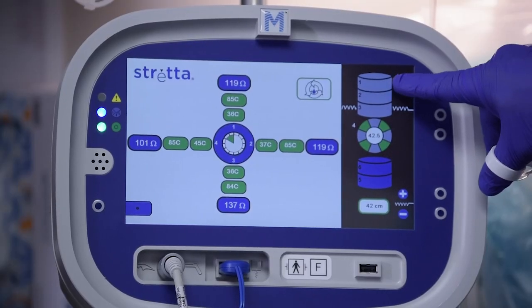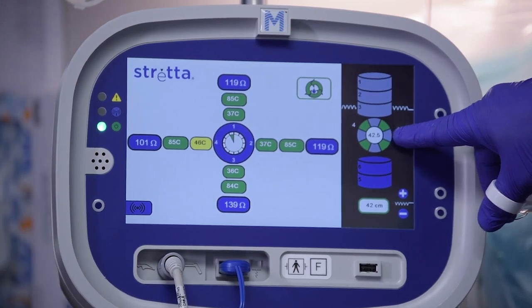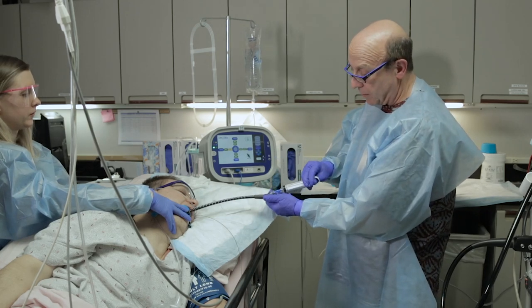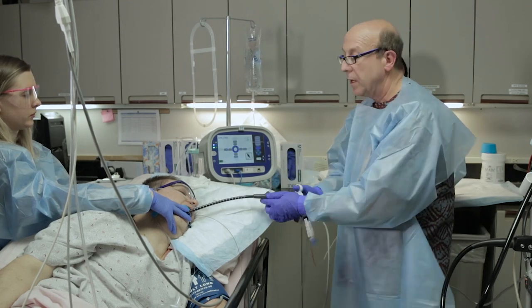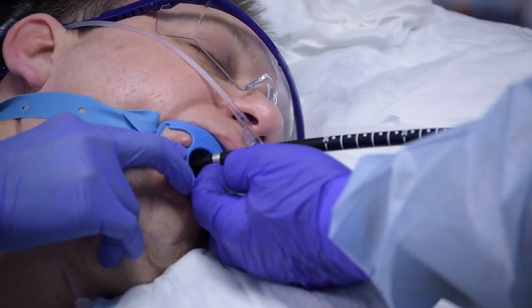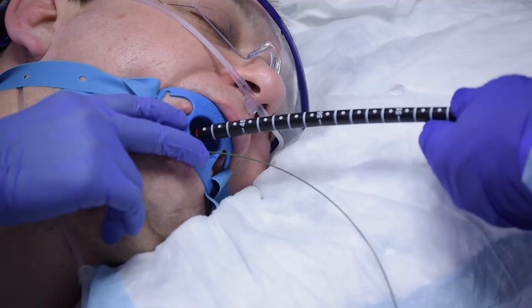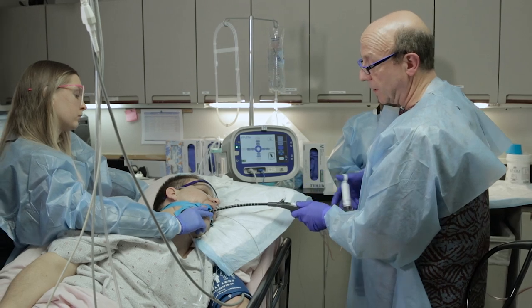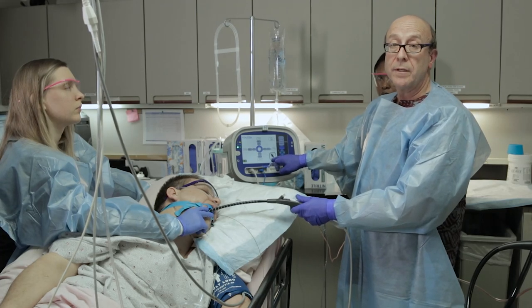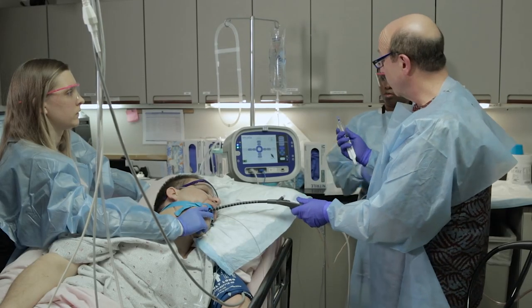We've gone through all four treatment levels — they've all grayed out, indicating we're done with our esophageal treatments. We pull those needles back, remove the air from the balloon, and pull the catheter up to the metal band for the last time. We now go down into the stomach, two centimeters below the marking of the junction between the stomach and esophagus. The machine is now telling me it needs a specific volume of air — 25 cc's — for the next set of treatments, so we remove the relief valve and put in that specific amount of air.